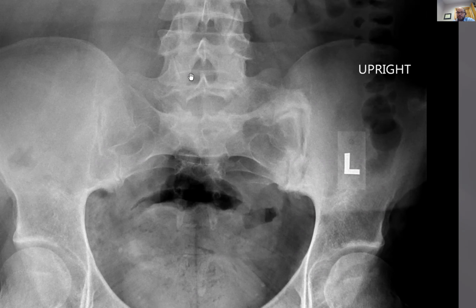And it proves, by the way, that altered biomechanics causes significant musculoskeletal changes in the joint. Gosh, this case proves chiropractic. You know why? Because early on, on the MRI, this SI joint was going to show up as really bright T2 signal before there were ever any changes in the SI joint.